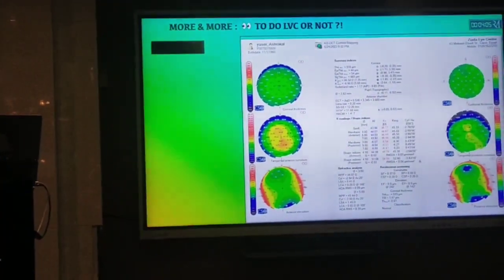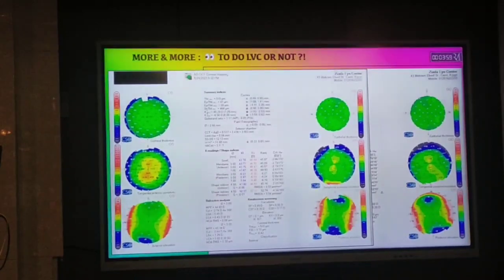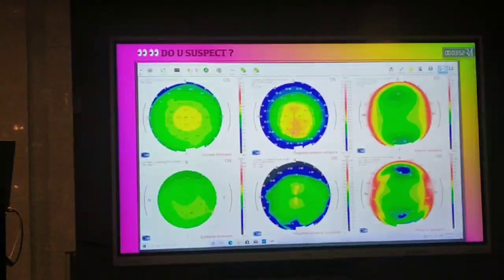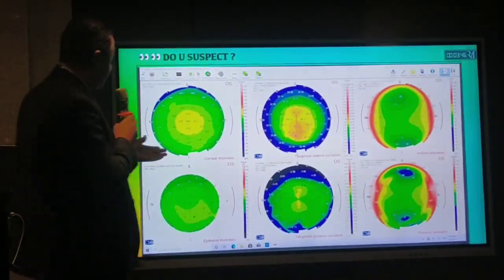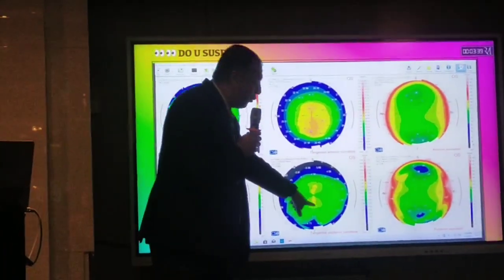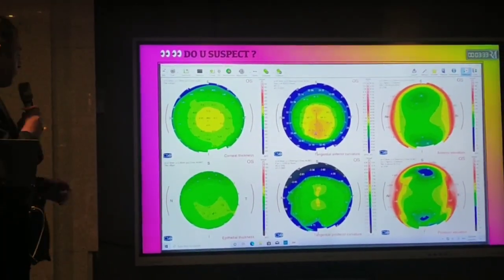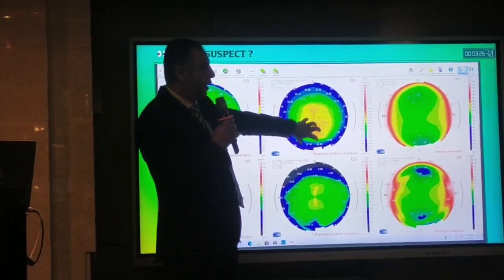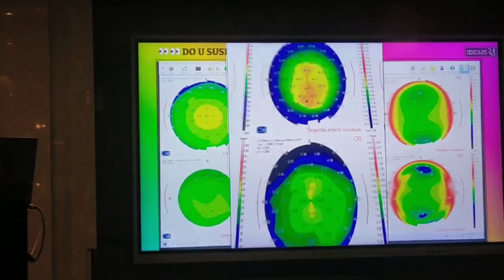Finally, do you do laser vision correction in this case or not? This is the right eye and this is the left eye with inferior steepening — very significant in topography. But when I looked at the other eye for this patient, I found a highly significant anterior surface steepening with a very normal back curvature. However, the epithelium is thickening, so I would be comfortable proceeding for this patient despite the highly significant anterior steepening.